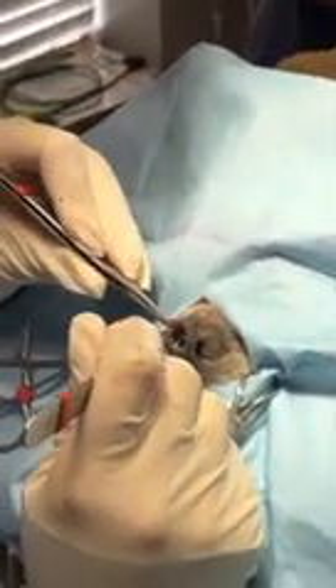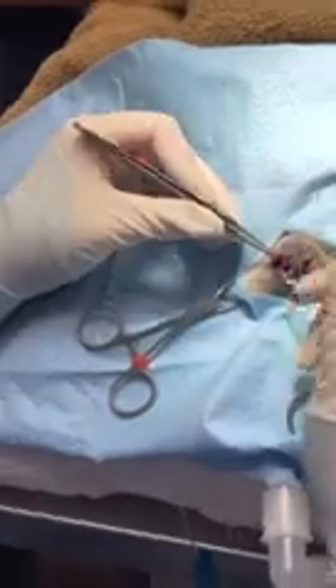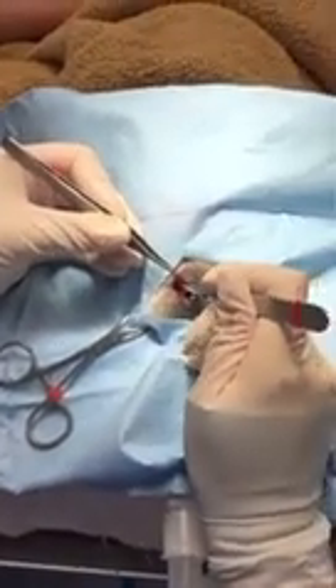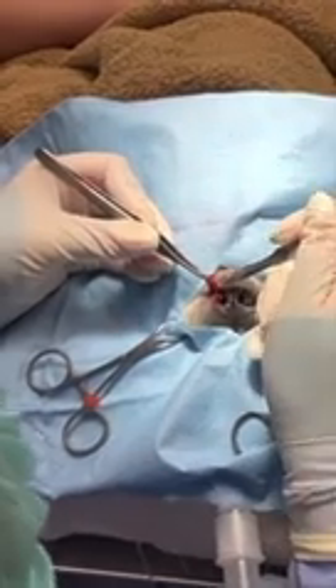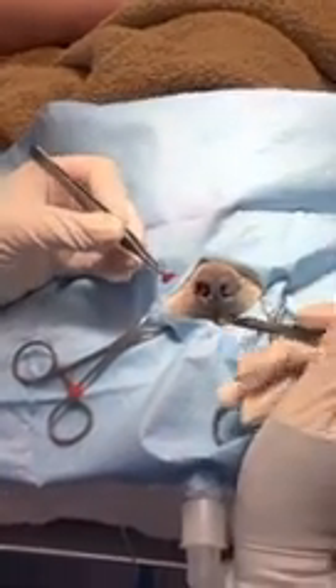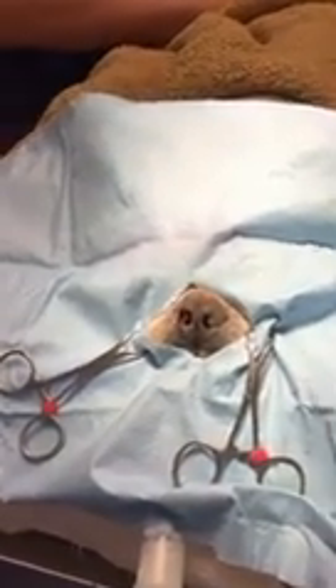Noses tend to bleed a lot — it's nothing major but they do tend to bleed some. You take that wedge out making sure you get deep there, so that you want to be able to see a nice triangular piece of tissue that has been removed from that nostril. After that, we just close.